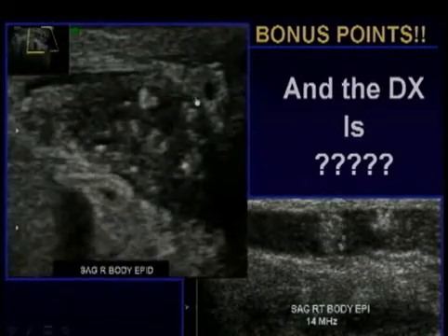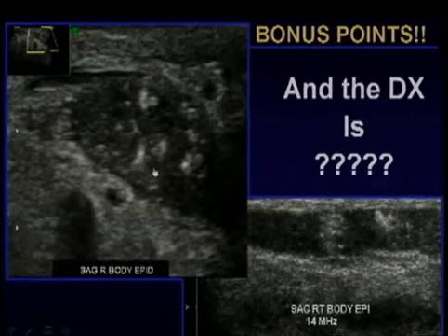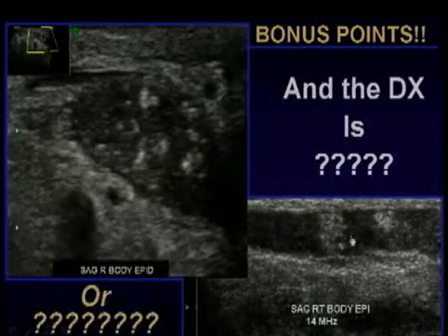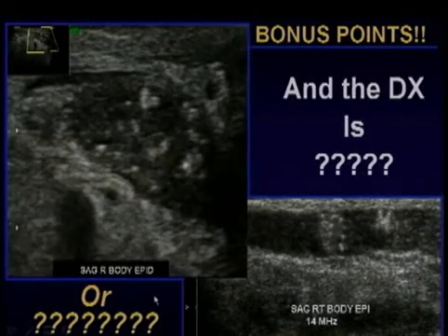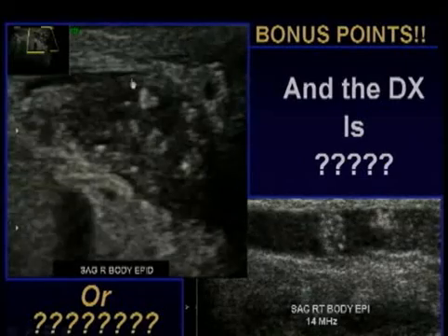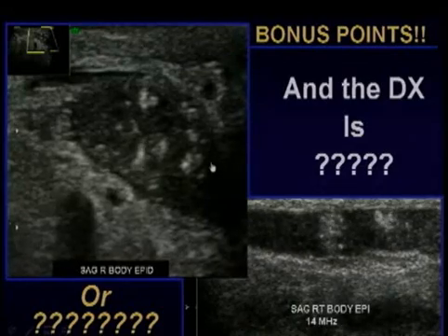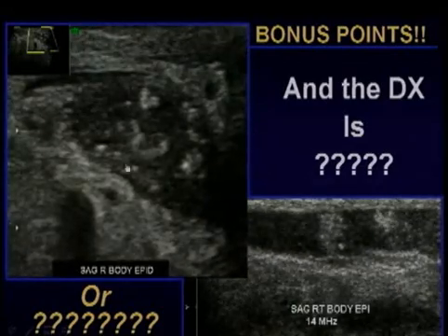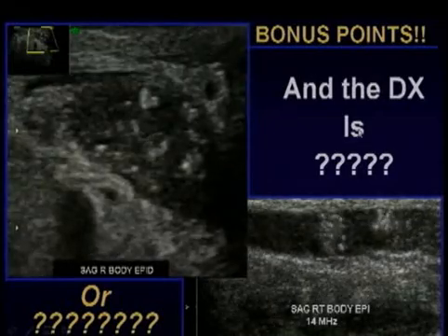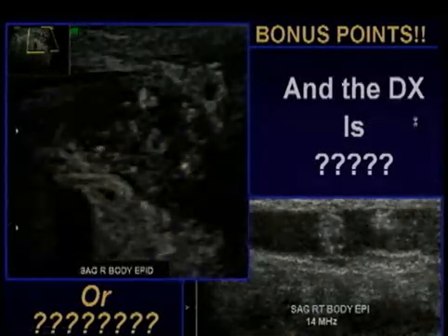But I'll show you a case that was done at the Brigham Hospital where until recently I was working, and this patient had never traveled, and this is not filariasis. I'm going to say, what is it? We don't know for sure, but most of these people, almost exclusively, had vasectomies. I know Mary Frades, who works at the Brigham, has recently looked at this, and she calls these dancing sperm. I don't know if you want to call it that because sperm are really too small to see, but these are concretions that are moving within dilated tubules and are probably of no significance, especially if somebody's had a vasectomy.